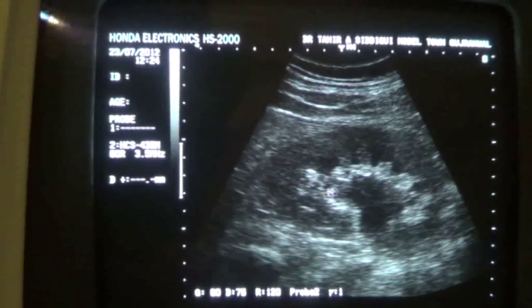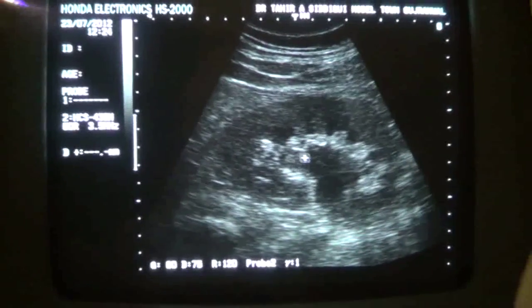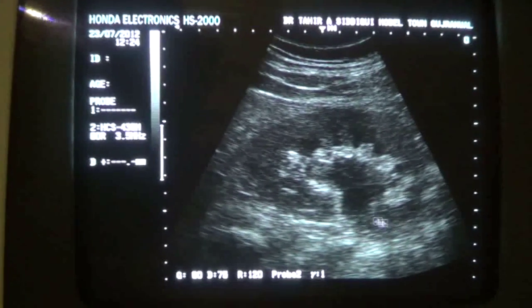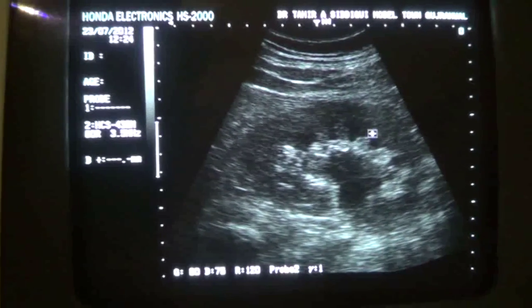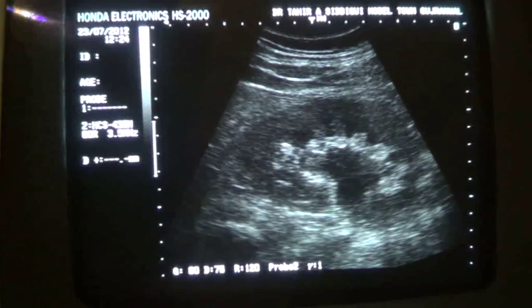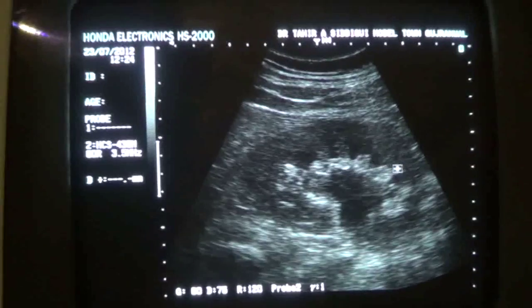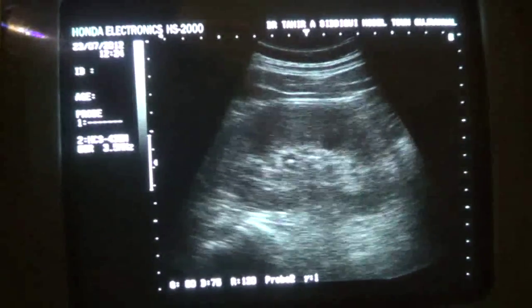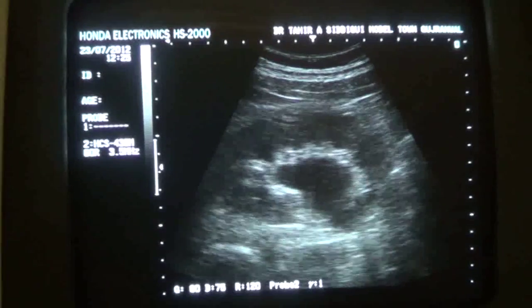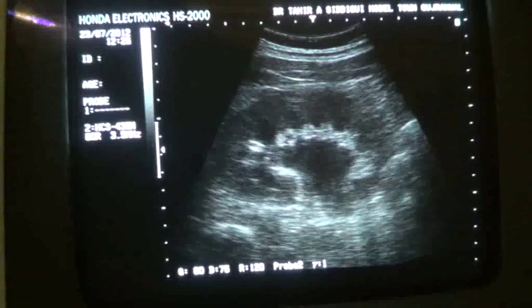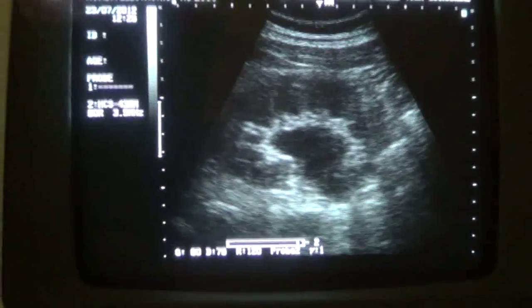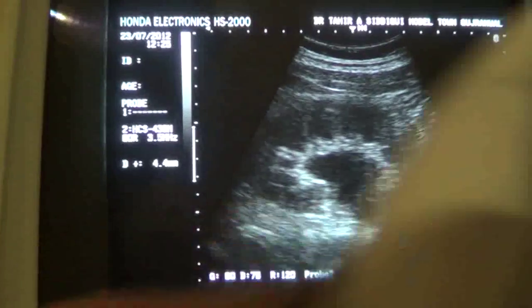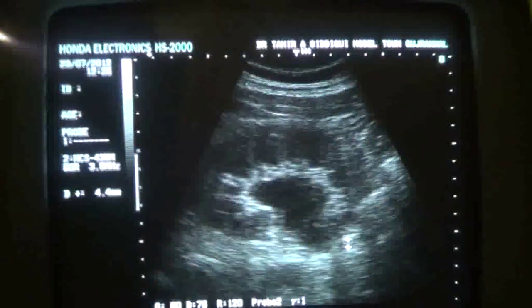These are dilated calyces — fluid in the dilated calyces, urine in the dilated calyces with debris in the proximal ureter as well. This is obstructive uropathy with no significant dilation of the proximal ureter. It measures 4.4 millimeters; normal should not exceed more than 7 millimeters.